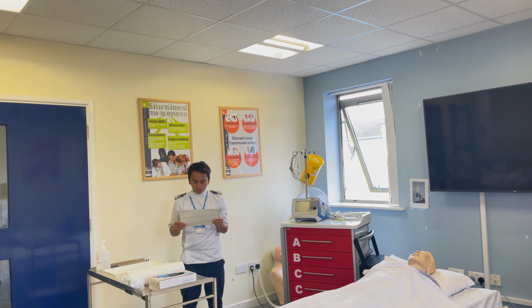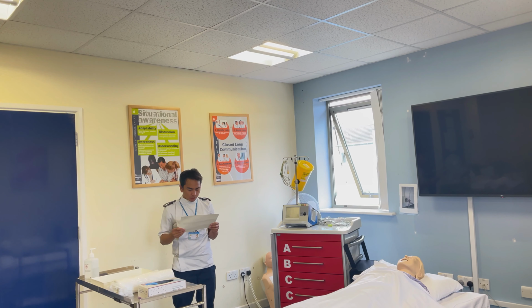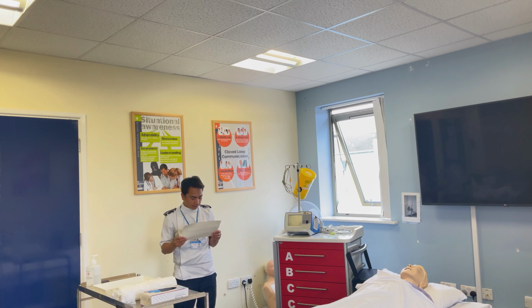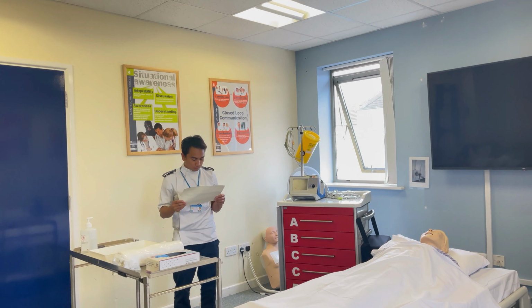Miss House is admitted to ward for monitoring. She had her IV cannula inserted yesterday after drawing some blood for culture and sensitivity. No IV fluid or medication was given, pending the blood results. The doctor has prescribed a normal saline flush. This patient is in a hospital setting. All the equipment you need is provided. Please administer the medication using the prescription below.